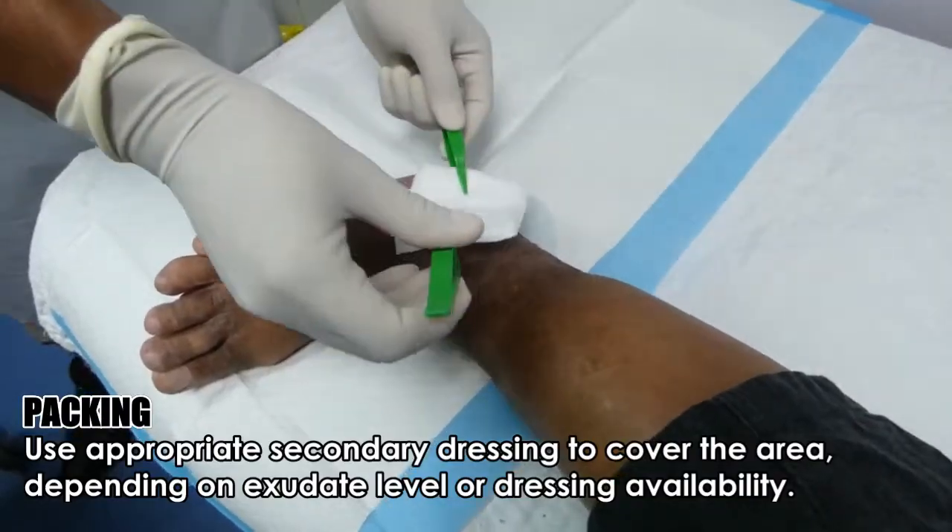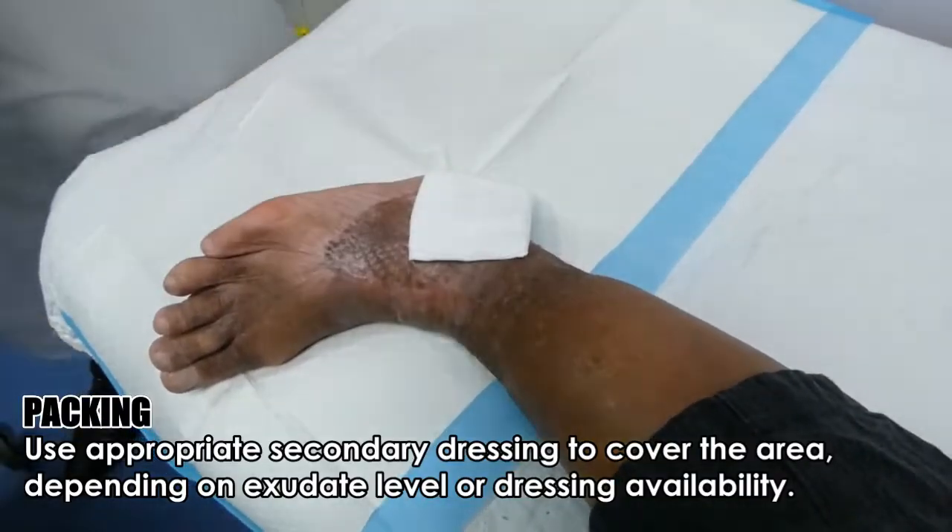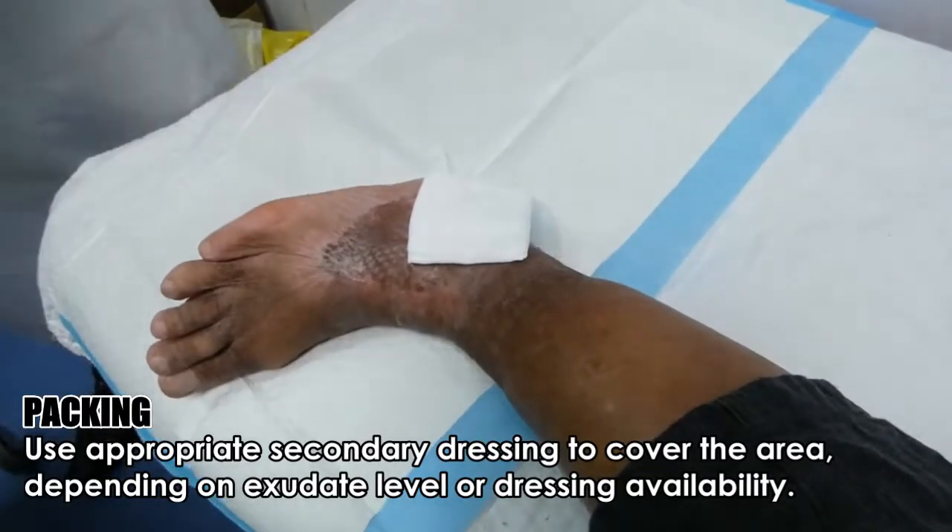Use appropriate secondary dressing to cover the area, depending on exudate level or dressing availability.